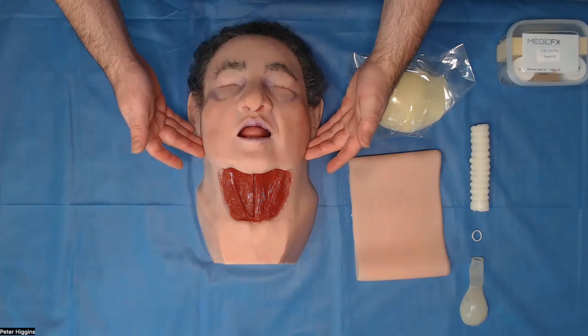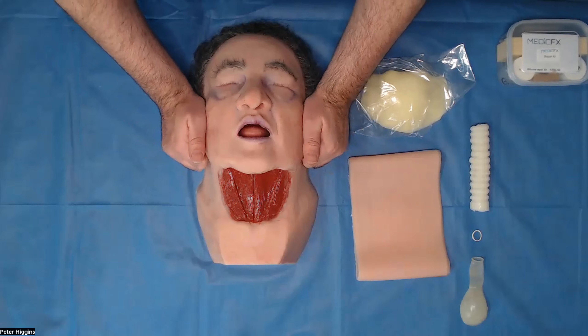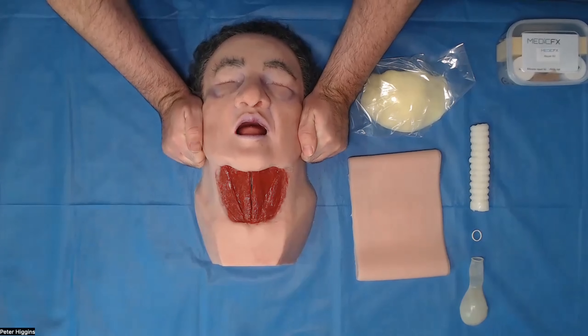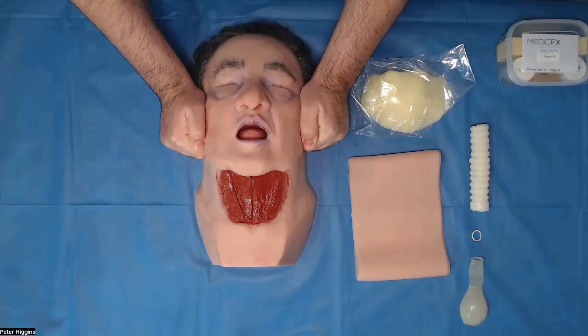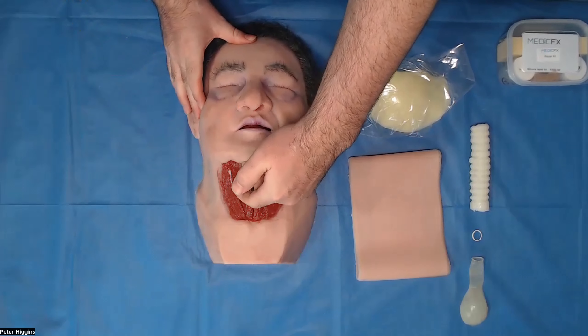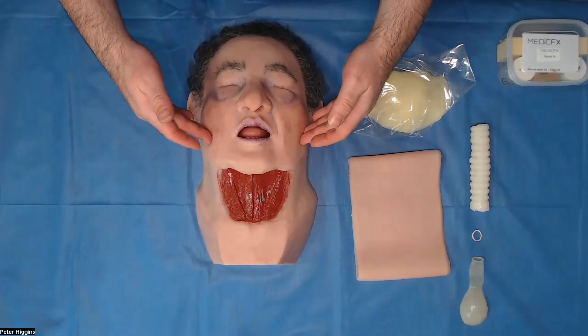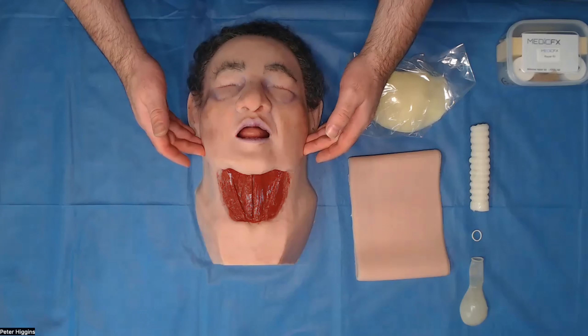The actual model itself features an inbuilt jaw, which means you can attempt a jaw thrust on this guy. He's really difficult, but there is definitely the angle of the mandible there to attempt your jaw thrust on. It is a movable mandible. He has all of the airway appearances and landmarks that you would be looking for in intubation. However, he is a grade four view.